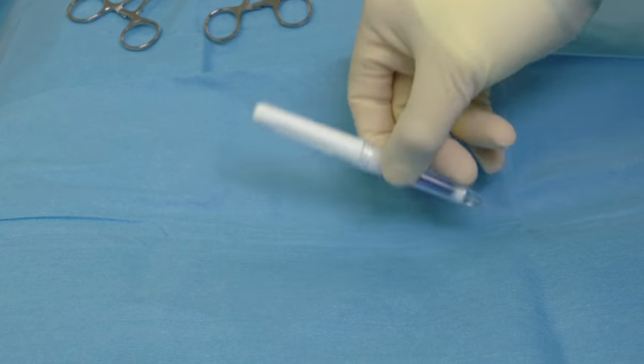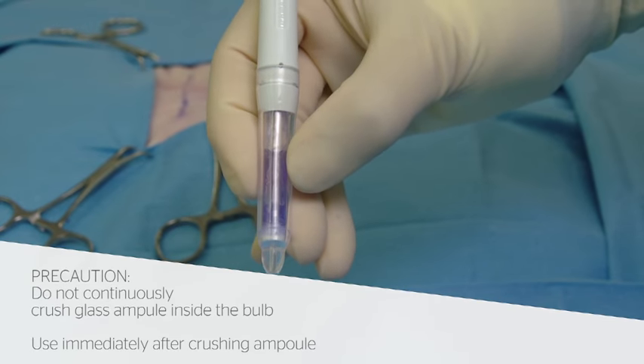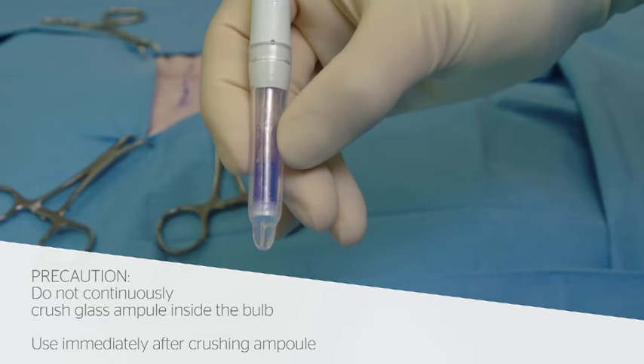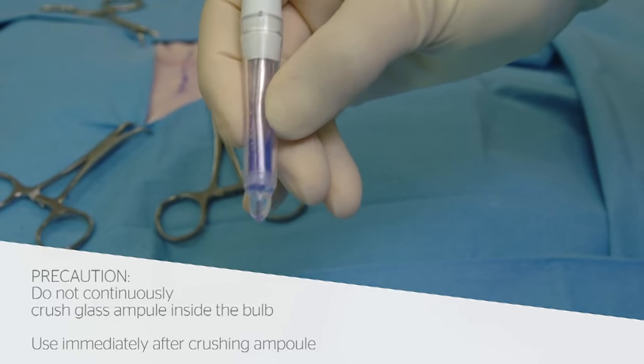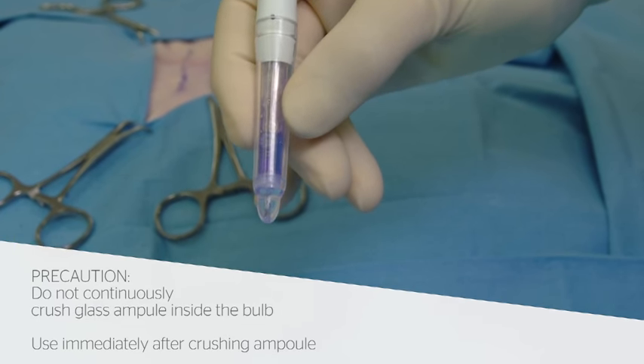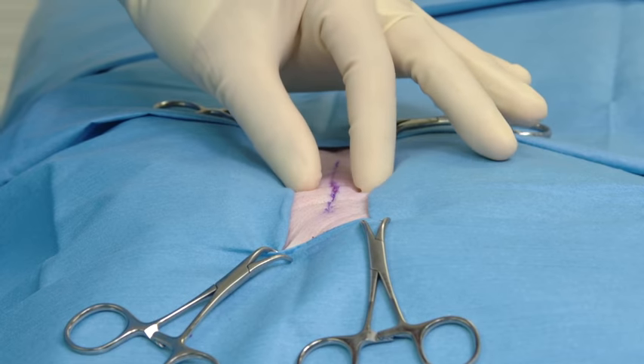While holding the applicator with the tip pointed downward, apply pressure at the midpoint of the bulb to crush the inner glass ampule. Gently squeeze the bulb to sufficiently moisten the internal filter, then stop squeezing to allow the adhesive to draw back into the applicator.